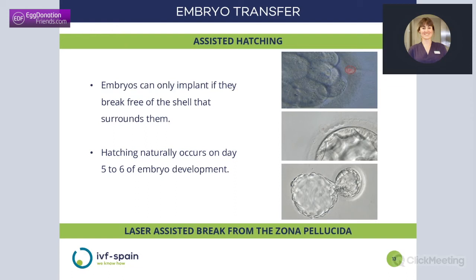In the laboratory, we can assist this process because this shell, we can make little breaks in it in the laboratory so that it will be easier for the embryo to come out. And when is this indicated? We find little benefit in performing assisted hatching in fresh embryo transfers. Fresh embryos should be able to hatch naturally.